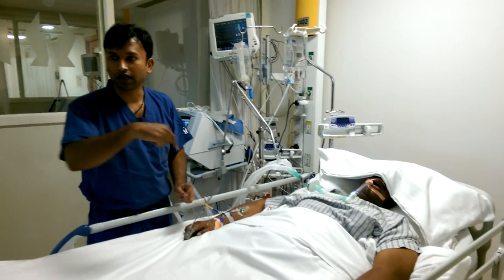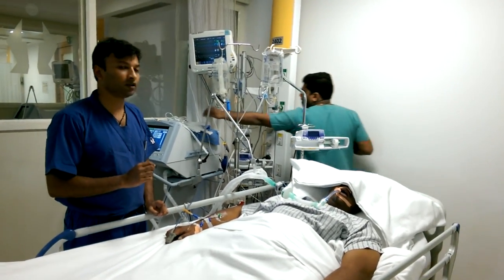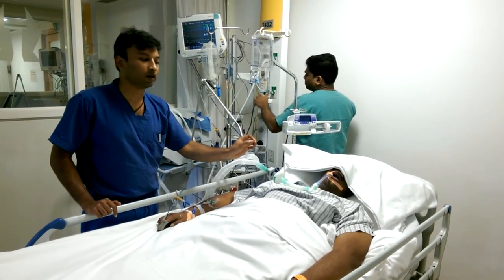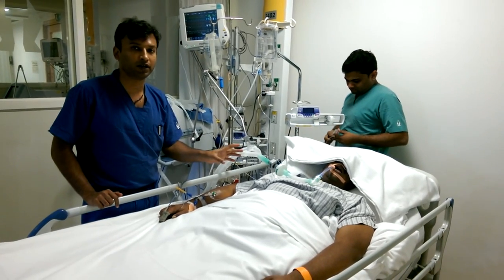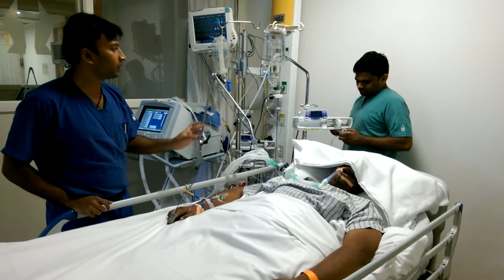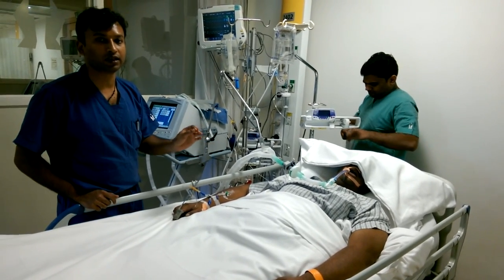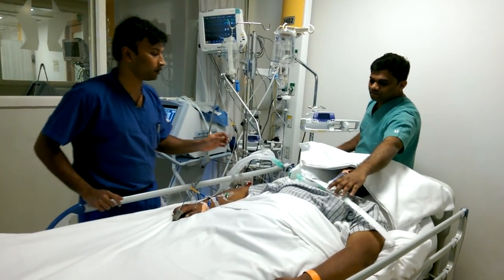What we do in the apnea test is we disconnect the patient from the ventilator, and we insert a catheter, and we instill oxygen at 5 to 10 liters per minute so that the saturation is maintained. During the apnea test, if there is a BP fall, we can always start a noradrenaline drip, and after the disconnection, we'll watch for respiratory efforts and a fall in BP.